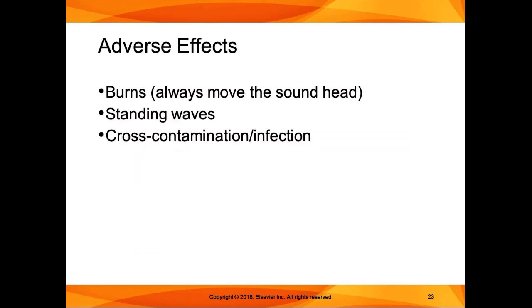So the adverse effects potentially of ultrasound are burns. If you don't move the sound head, you could burn somebody, because that peak area of intensity, that spatial peak, is going to be in the same place. So you always want to move the sound head at 4 centimeters per second. Standing waves, and we'll talk about those in a second, and the potential for cross-contamination and infection. So I just make it a general rule: I sterilize the ultrasound head before and after I use it. I don't assume that the person who used it before me sterilized the head. They probably did, but I don't assume that. I sterilize it before and after I use it on the patient.